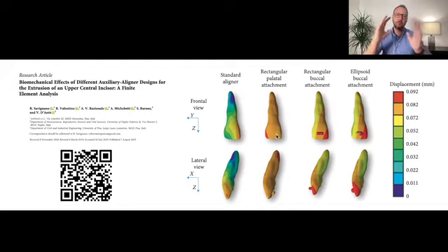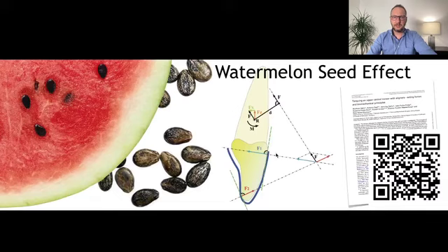When we need to use binary forces to close spaces, I prefer bonding on the buccal surface, explaining to them that we can have a better result here. But again, good result with the lingual attachment.